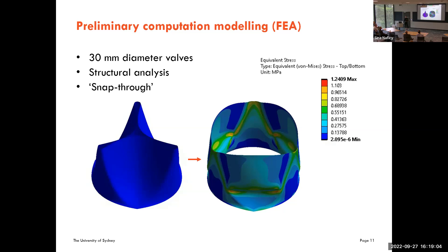After establishing the design, material, and fabrication process, we carried out computational modeling using finite element analysis. This is a simple structural analysis — no fluid applied — just to examine how the valve behaves under applied pressure, though we do plan to incorporate fluid later. We used a 30 mm diameter valve. An important concept here is 'snap-through' — the ability of the valve to fully open by bending against its natural curvature during systole.